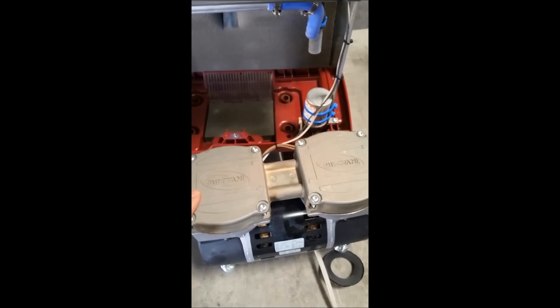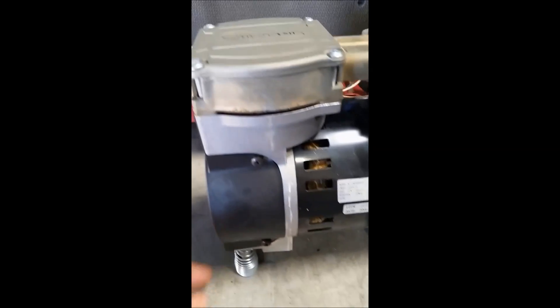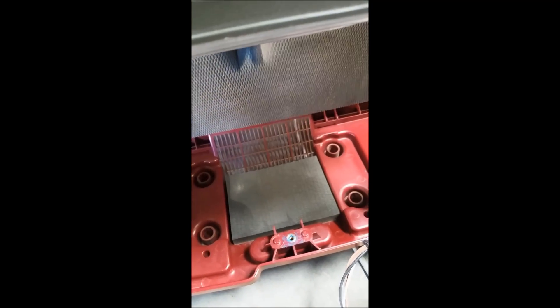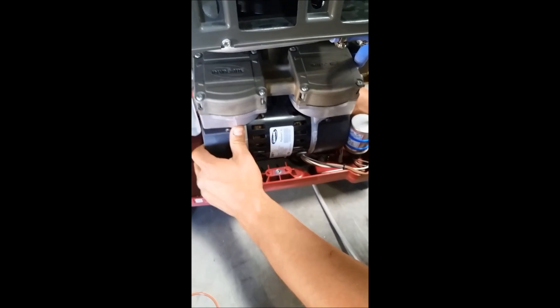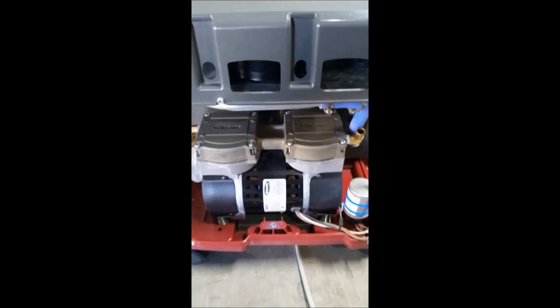Now we're going to pick up the compressor and flip it around and put it back inside the concentrator. You'll see here these springs are going to go into these holes right here — it'll rest inside, and once it's balanced in there you'll know that you have it correct. Flip it up, put it in, and adjust to get the springs right. Now it lays flat all the way across.